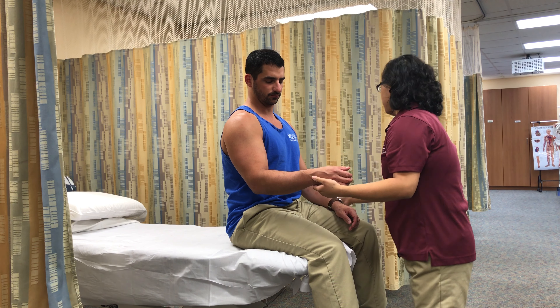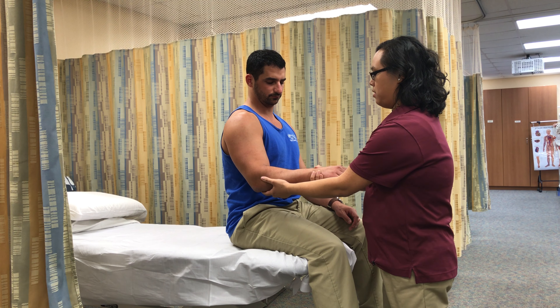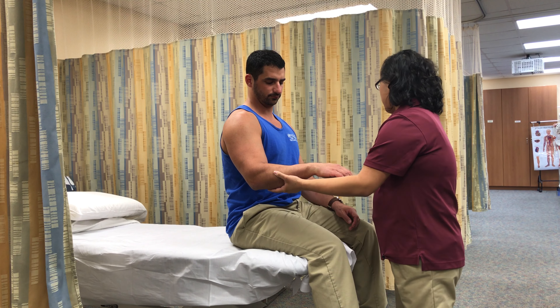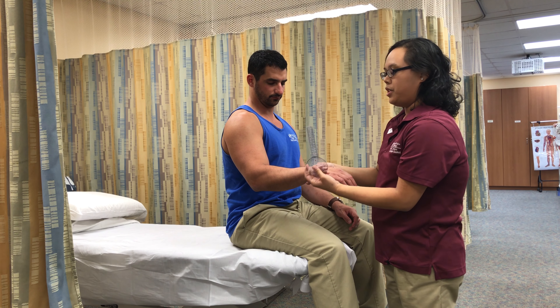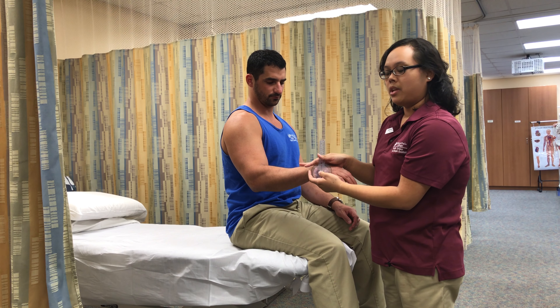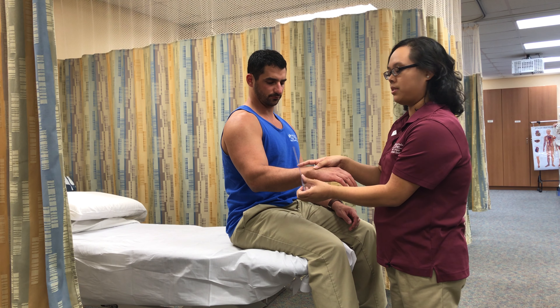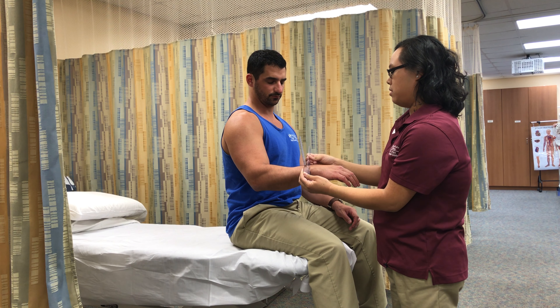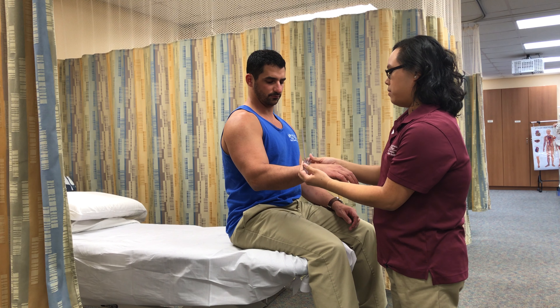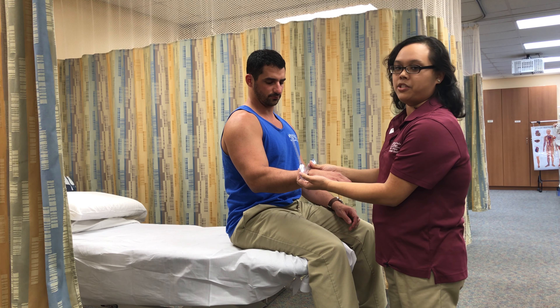I'm going to remove the goniometer and perform passive range of motion, then replace the goniometer. Usually you would use a semicircle goniometer, but we're using a full-circle one, so just adjust it so that it's at the ulnar styloid process. I'm going to measure the available range of motion, and that appears to be 80 degrees.